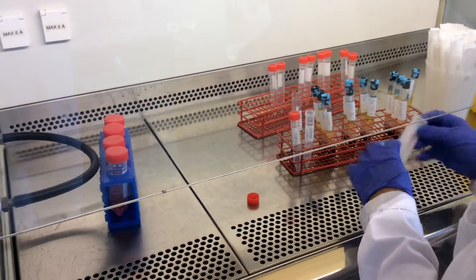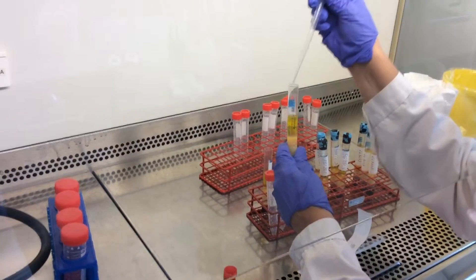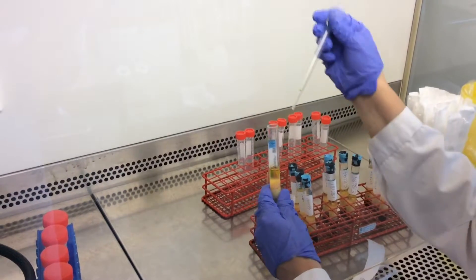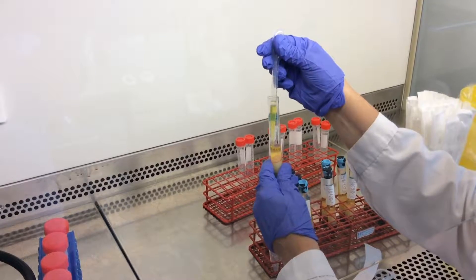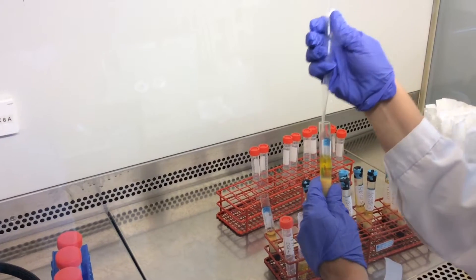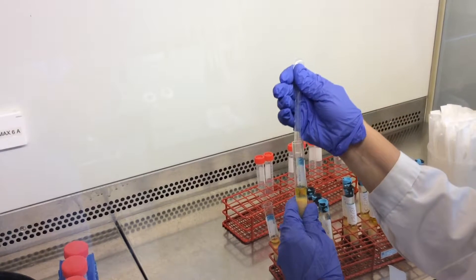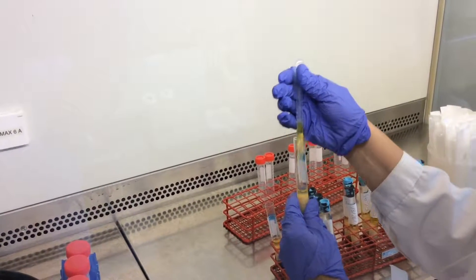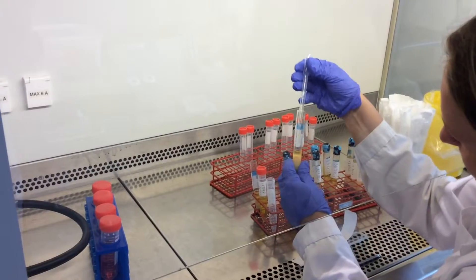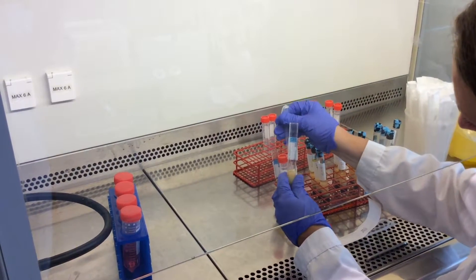Magdalena will now harvest the plasma. She has to leave some plasma above the white blood cells so as not to get any white blood cells into the plasma fraction. Now Magdalena is harvesting the white blood cells from this subject.